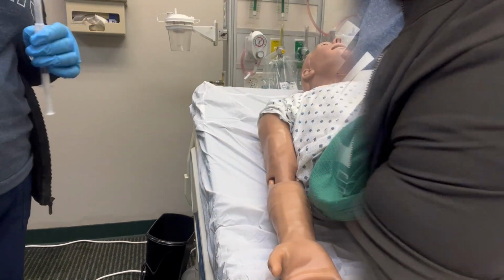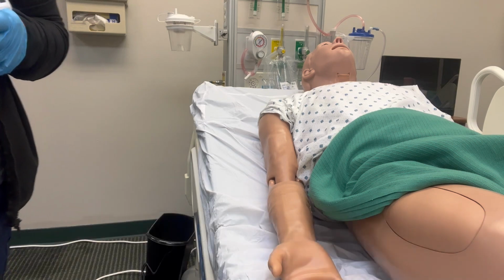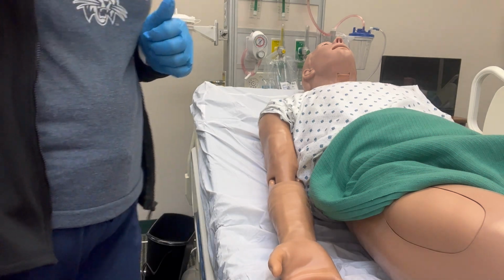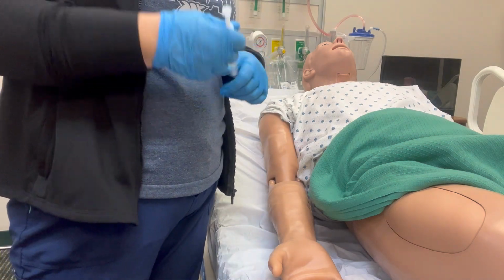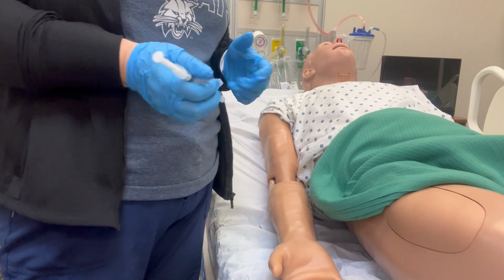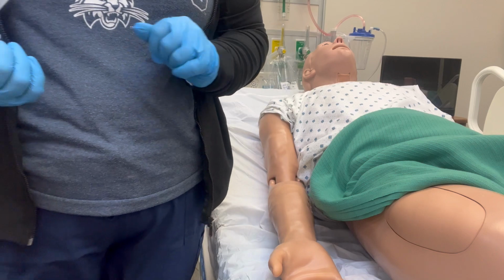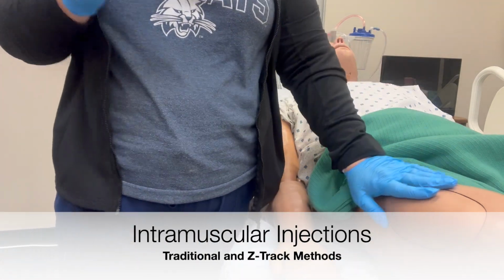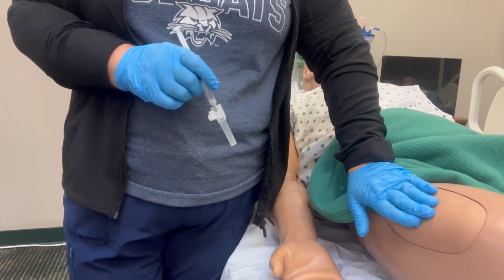Depending on which method you're using, we have a traditional method and we have a Z-track method. The traditional method is where we're just going to inject the medication and pull the needle out. The Z-track method is where we have a little track to prevent the medication from leaking back to the skin surface. So just for demonstration purposes, we've already got our med and we're going to give it in our patient here at this site.